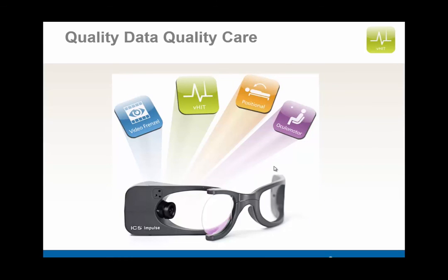Again, quality data equals quality care. So make sure you're doing everything in your possession to make sure that the data is collected appropriately, you have good pupil detection, you do the head impulse maneuver properly, and then you interpret the data accurately.